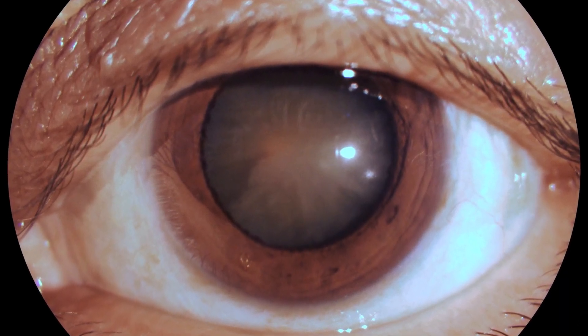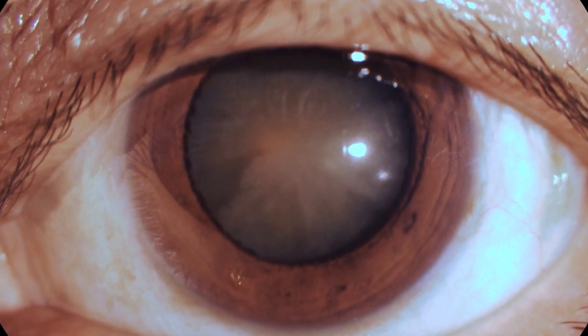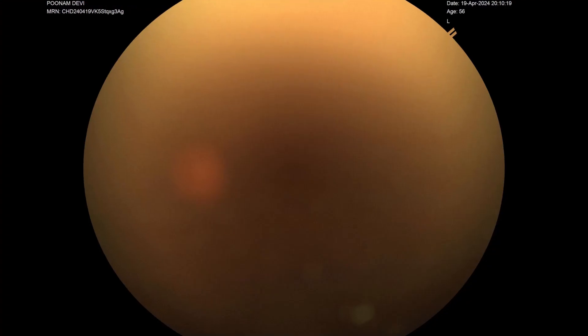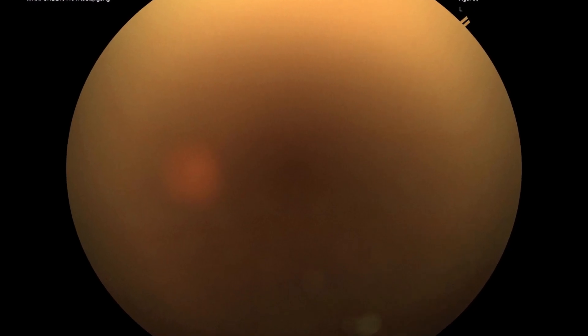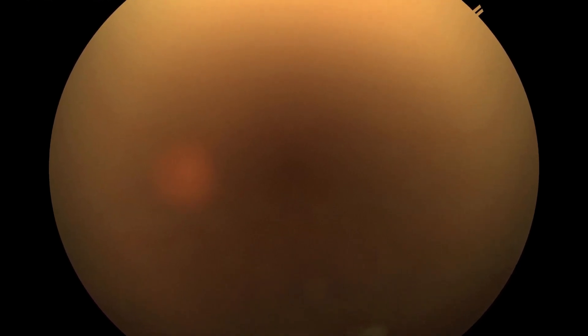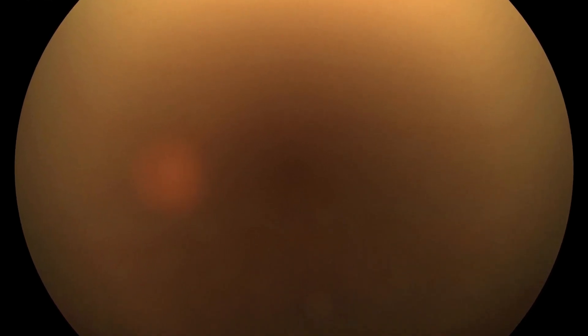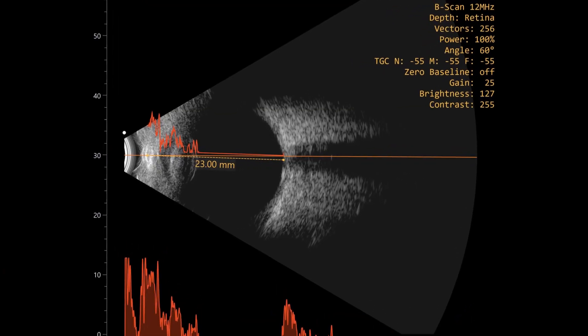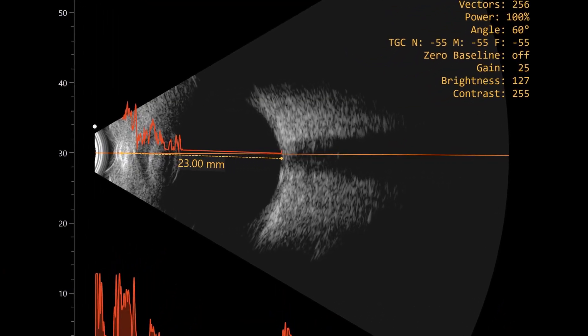This is a patient with a significant cataract which is brown in color, and this is the fundus photograph. Because the view was not perfect, a B-scan was done, and this is the B-scan. Now this surgery is about managing hard nucleus.